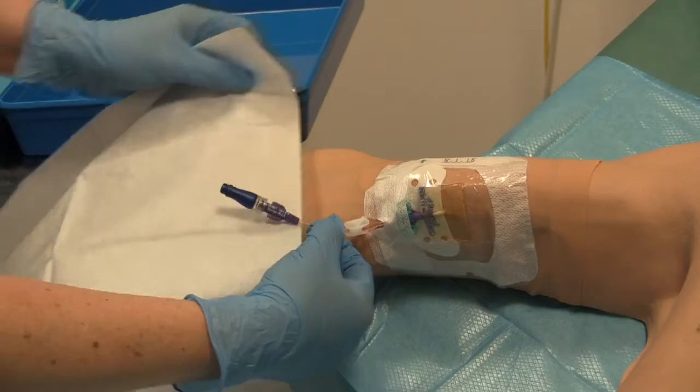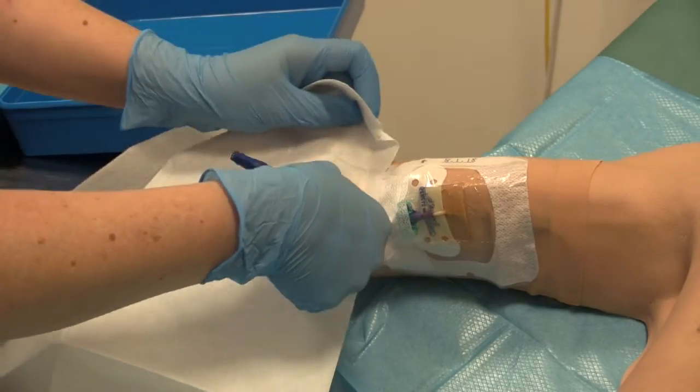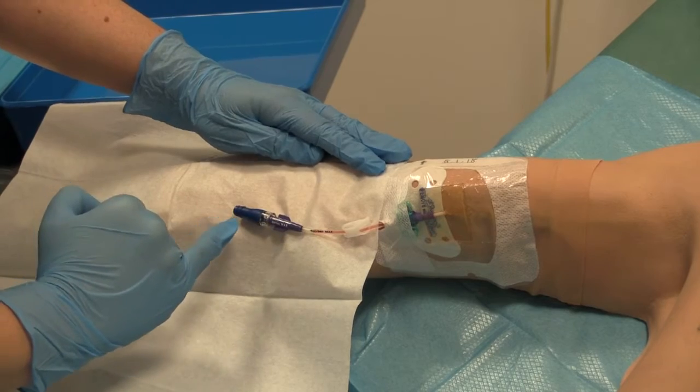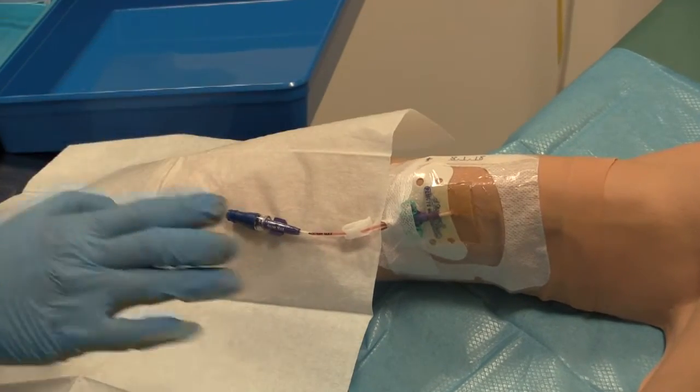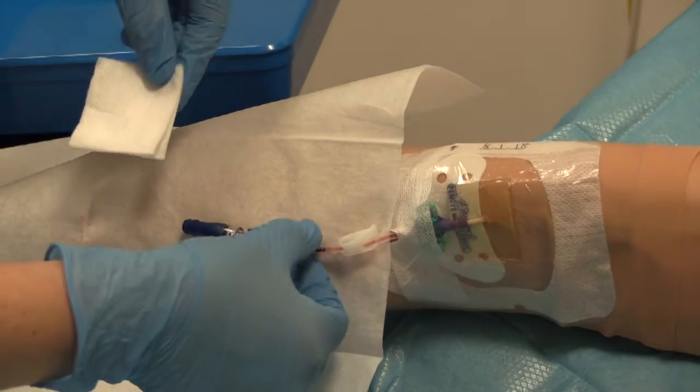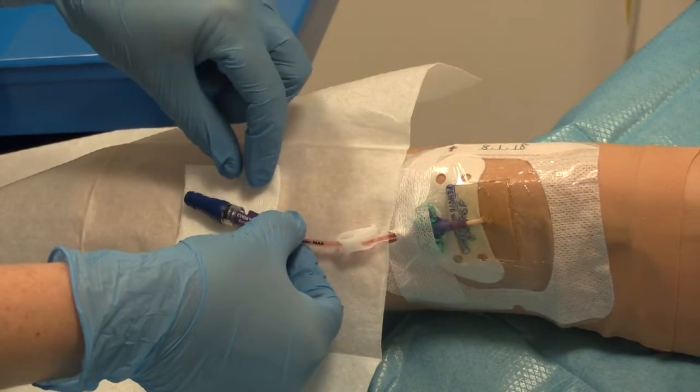Place the clinical laminate sheet between the line and the patient's arm, being aware of the key parts of the port and the needle-free valve. In addition, you may place some sterile gauze underneath the key parts to help with the procedure.